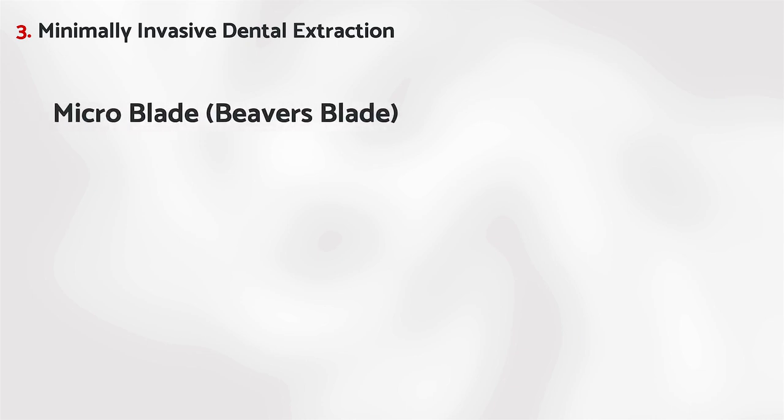Step 3. Minimally invasive dental extraction. Just a quick review. We can use, since the beginning, the microblade to promote an intrasulcular incision, the Beaver blade. The use of periodontal and mini levers in the palatal wall approach. Using these tools like a pendulum, always approach the palatal wall. We never touch with these tools, neither periodontal nor mini levers, the buccal aspect.